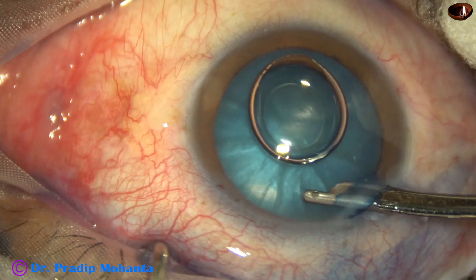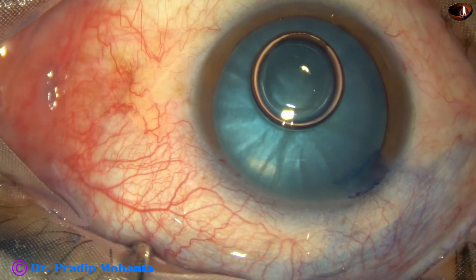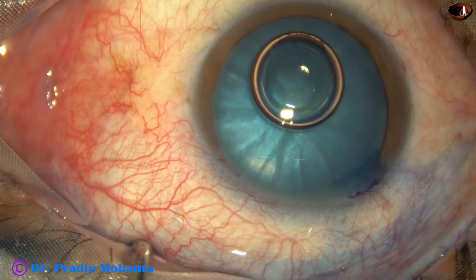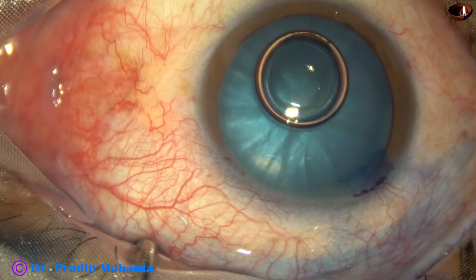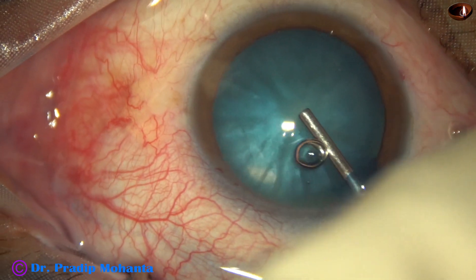The dye is washed out with BSS just after application, and you can see that there is deep staining of the anterior capsule.